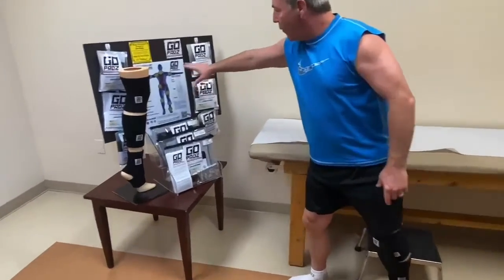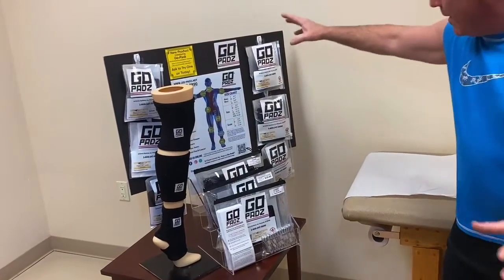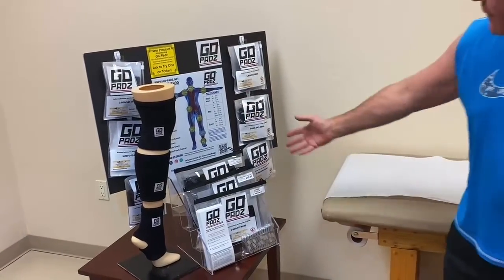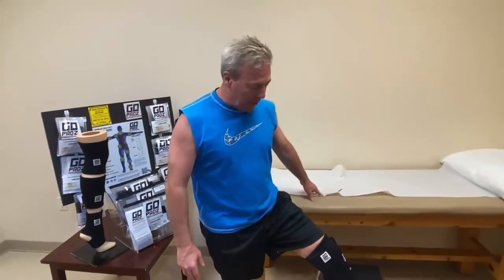This is for every part of your body — your wrist, elbows, shoulders, neck, biceps, hip, thighs, knees, calves, and ankle. I just happen to have the leg package, and I'm so happy with my GoPads product. If you're recovering from surgery, get this as part of your recovery routine.